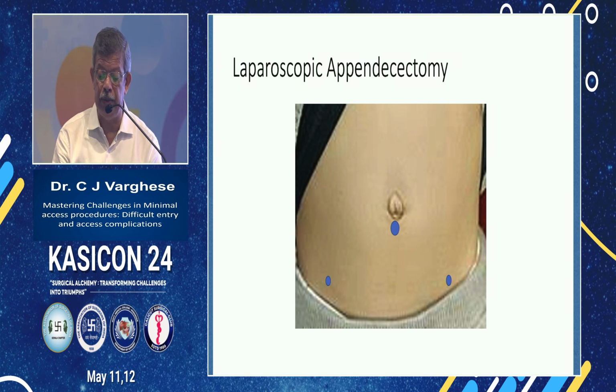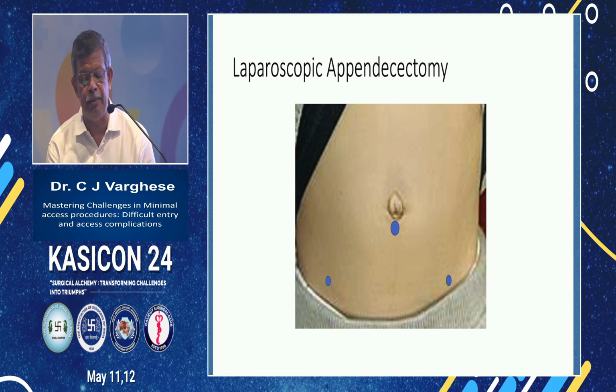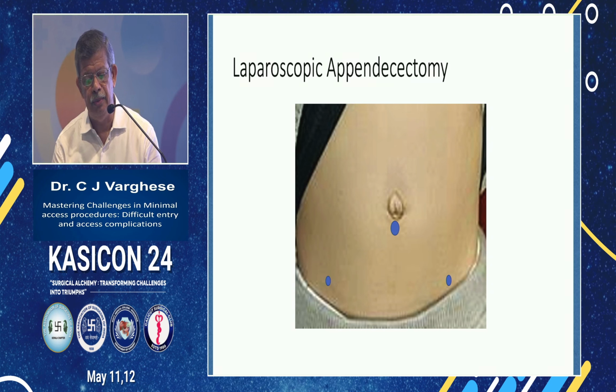Here actually is one appendicectomy, which I was doing long back, I don't know whether Dr. Alfie remembers it. This patient was a routine appendicectomy. The instrument was passed from the left iliac fossa port, and actually it went through the sigmoid. The sigmoid was dilated and distended. When the assistant passed the instrument, the Maryland, it went through and through, and the camera was not focused on that, it was on the operative field.